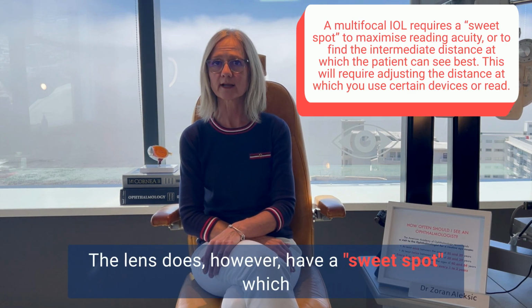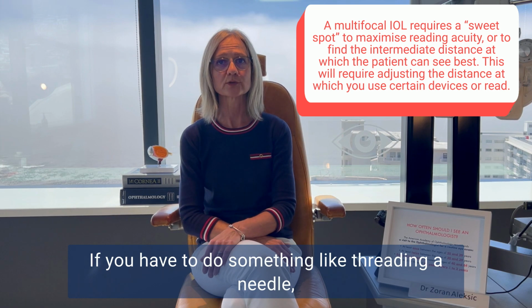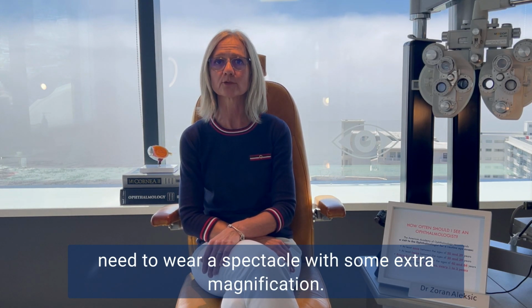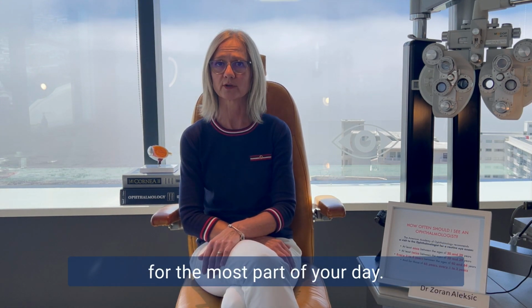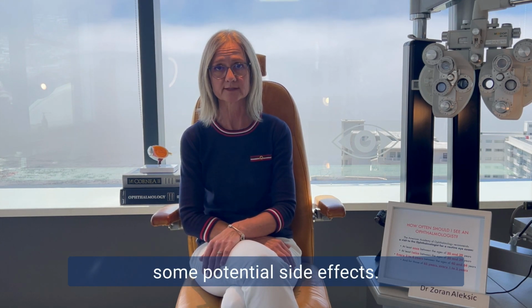The lens does, however, have a sweet spot, which is set for about 35 to 40 centimeters. If you have to do something like threading a needle, or if you have a certain hobby that requires a very close working distance, like jewelry making, you will still need to wear a spectacle with some extra magnification. So the big advantage of a multifocal lens is that it can potentially make you independent of glasses for the most part of your day. It does, however, come with some potential side effects.